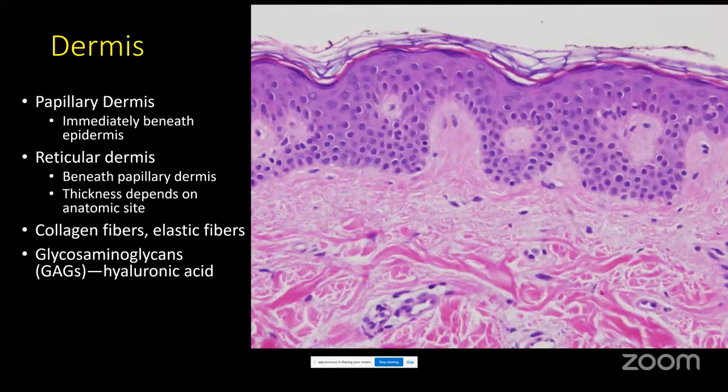I'm sure most of you have seen some skin, but we'll take you back to medical school or early residency to show you what the histology looks like for normal skin. You have the stratum corneum, normal epidermis, and this little tiny area underneath the epidermis with these wispier, fine collagen bundles is the papillary dermis, and this can get expanded or fibrotic and sclerotic, and different things can happen here.